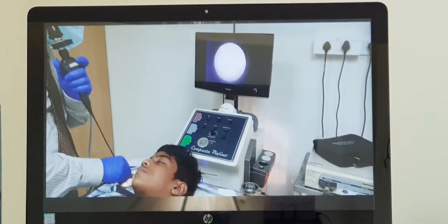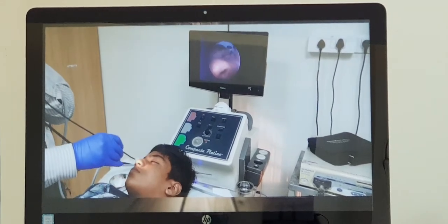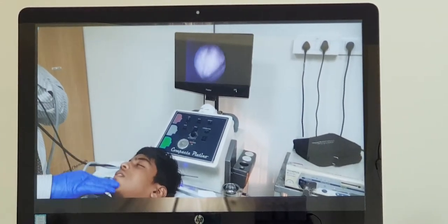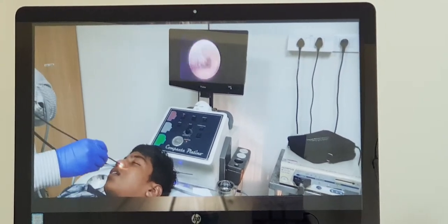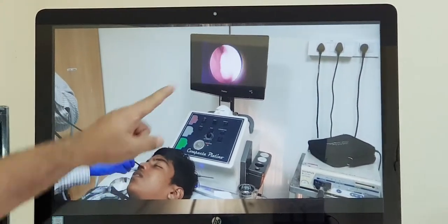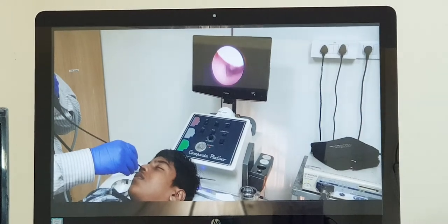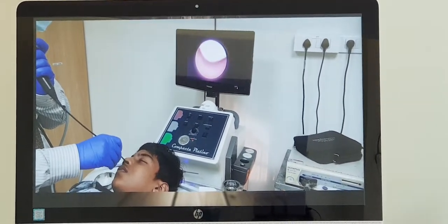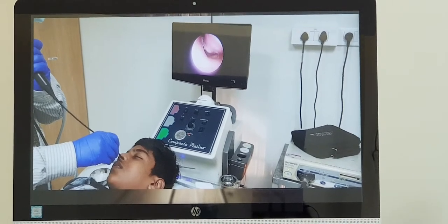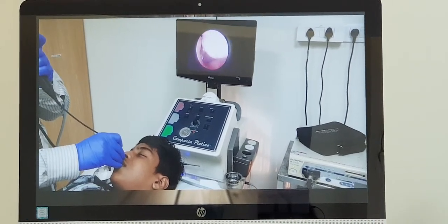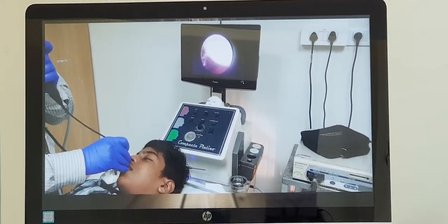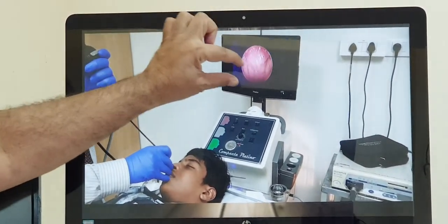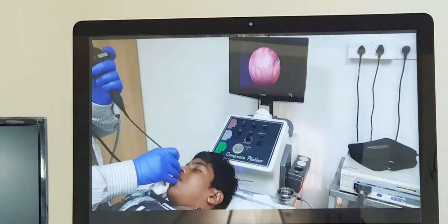Sometimes you need to do some suction, otherwise it is okay. We are proceeding with the endoscope. The patient has to open his mouth and breathe now. You can see on the monitor I am examining the nasal cavity, proceeding towards the part behind the nose which is called the nasopharynx. Once I reach the nasopharynx, I will instruct him to breathe through the nose so that this part opens up and I can proceed.